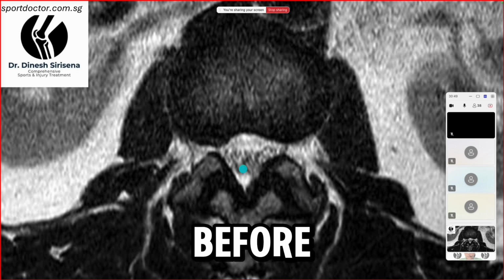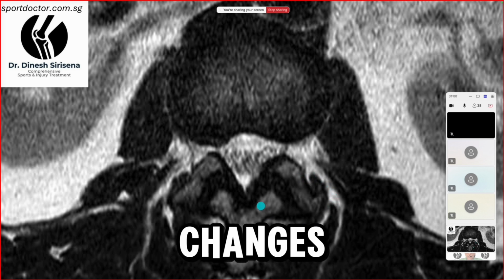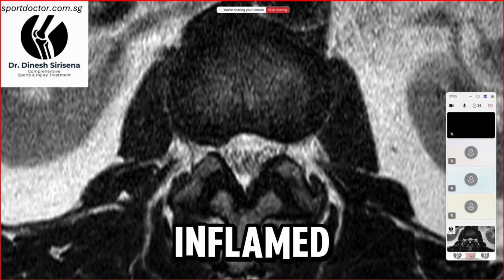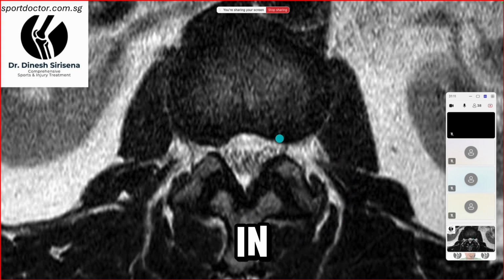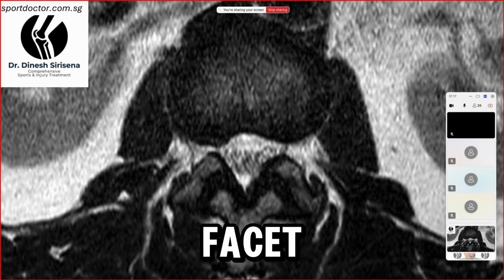This is what I was talking about before. Here we have a disc, we have the foramen here, and you can see there is narrowing as well. But you can already see that there's significant degenerative changes in those facet joints as well. As these facet joints get irritated and inflamed, there will be an inflammatory process going on around here. Even in patients with degenerative disc changes, it's very useful to consider the facet joints. And it became another area of interest for me as I moved through dealing with more back pain over the years.